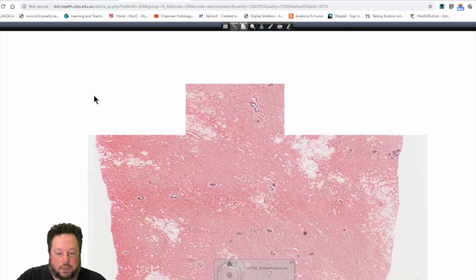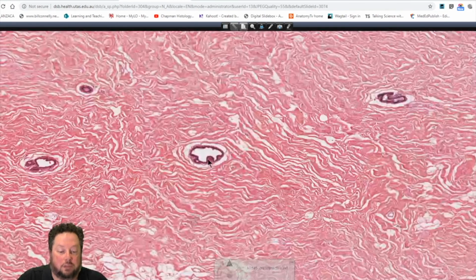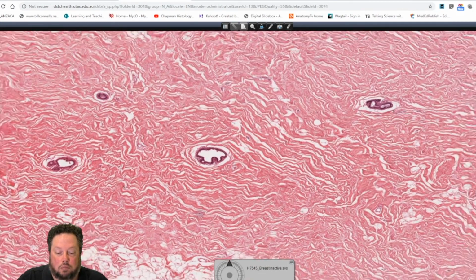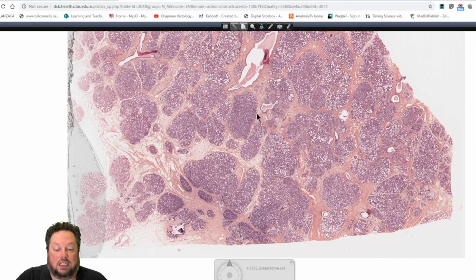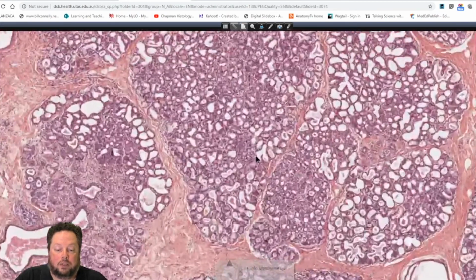All right, and again, this is another section of an inactive mammary gland. You can see it's largely just connective tissue and then just some of these duct portions, these lactiferous ducts. Really not much else going on there. But when the person gets pregnant, then we begin to get these quite dramatic changes. So you can see here now we've got these little lobules forming within the structure of the mammary gland. There's a very large dilated lactiferous duct here. So we zoom in here.